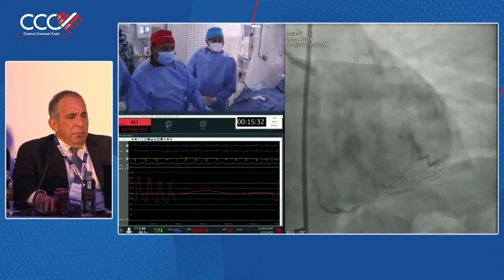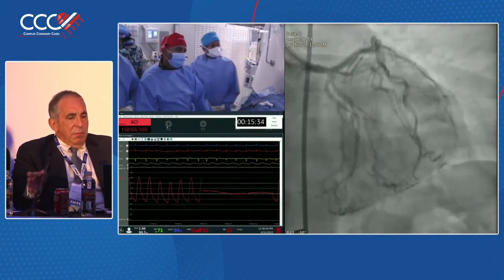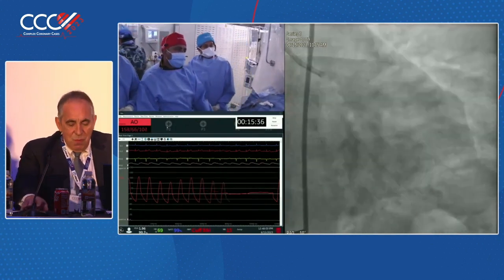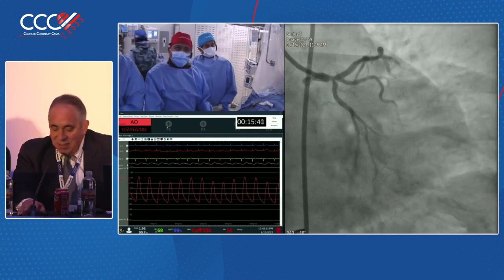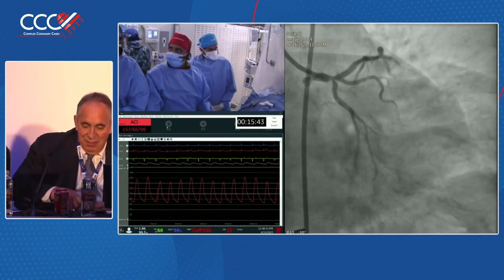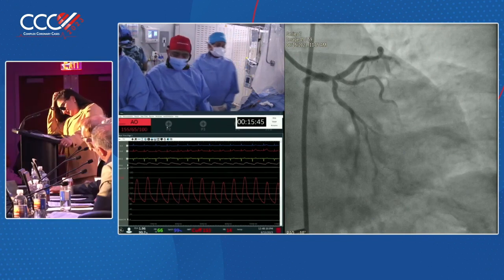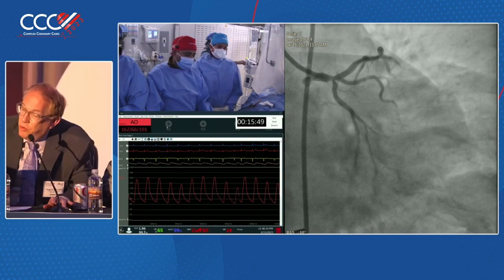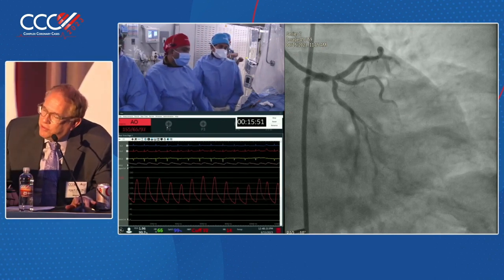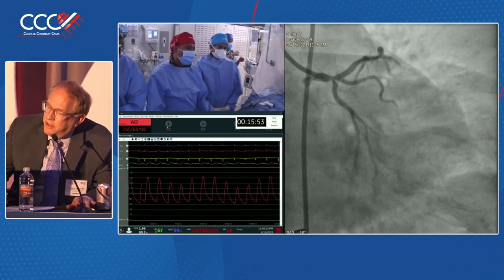It's a little ambiguous to me too, and then the angles are really easy, so you recross and image. I'll go to Greg, and that's what he'll say. He's not going to tell you anything until he images it. Yeah, of course I'm going to image it, but I'm definitely going to stent into the LAD, and I totally agree with Antonio here. I'd do a cutting balloon into the circ. I would do 3 wires. Maybe you don't have to treat the ramus, but I certainly would protect it because it's very large.